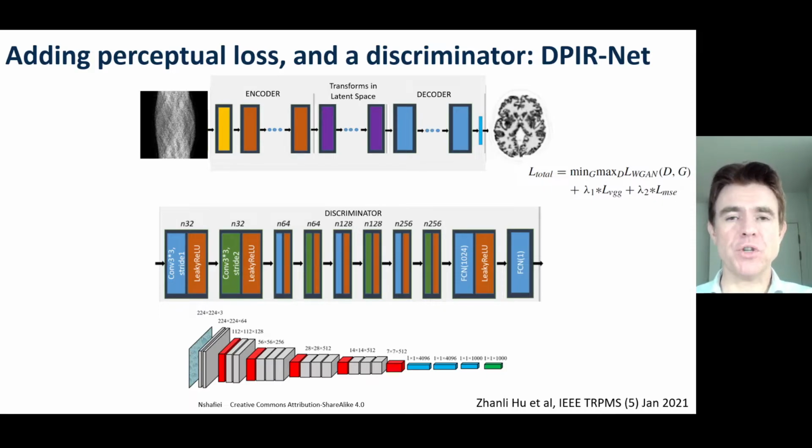So for example, in this context, we would have a whole training set of example desired output reference high quality reconstructions, and the discriminator can actually learn to say, given a reconstructed image, whether or not it is a member of the high quality set. In other words, it thinks it belongs to the training set, it thinks it's an authentic high quality image, but it will learn whether to classify it as that or as something else, in other words, some poor quality generated reconstruction. If you like, you can call it a fake or an authentic output.